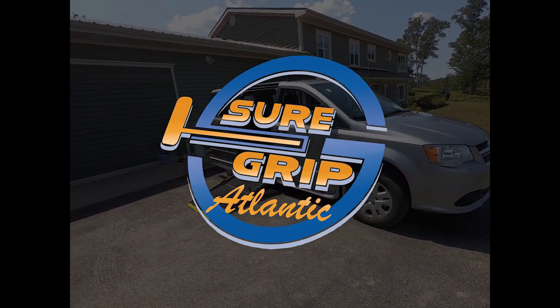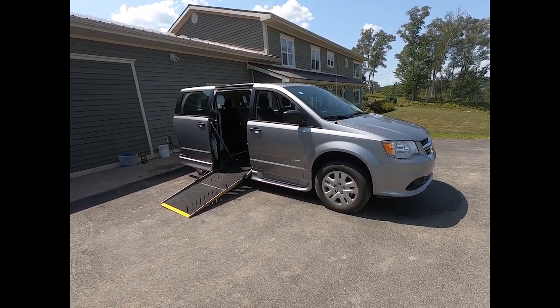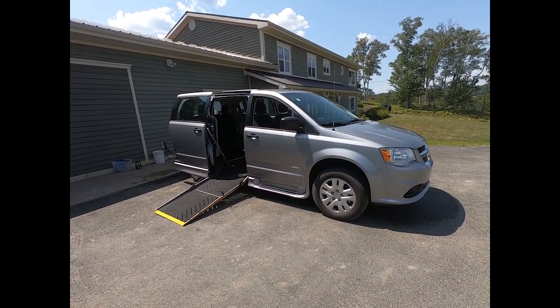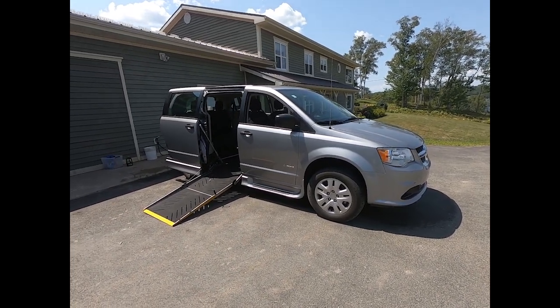Hey guys, Pat with ShareGrip here. We're getting ready to deliver this new wheelchair accessible van to a client this afternoon, and we did something a little bit special on this one — we wanted to show everyone how it works.